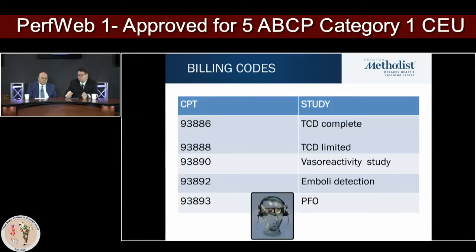The other important part is the breath holding index. With a simple 20-30 second interruption of your breathing, it tells us how well trained your vessels are. The vessels need to react immediately to lack of oxygen or CO2 increase, and with that diameter change, the vasomotor reactivity can be tested. And last, the emboli detection; I'm going to show you some examples for emboli detection.